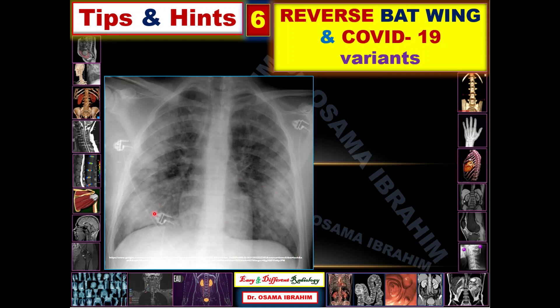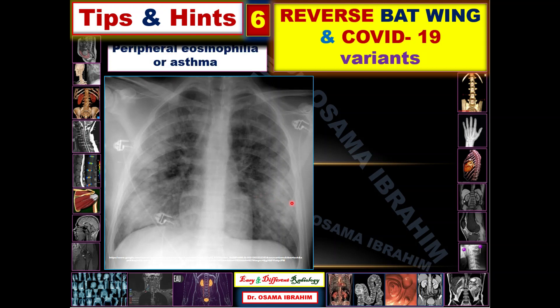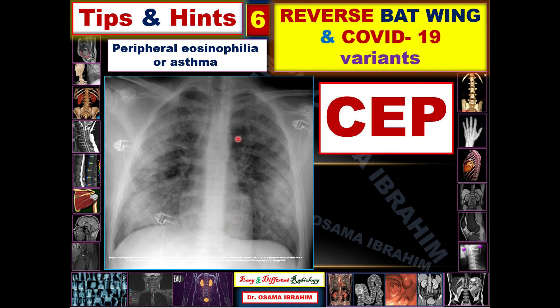This is again the frontal chest radiograph I used to start the presentation. There are peripheral consolidations with sparing of the perihilar regions, which can be described as a reverse batwing sign. In this case, we have a history of peripheral eosinophilia and asthma, so you can easily diagnose it as CEP — chronic eosinophilic pneumonia.